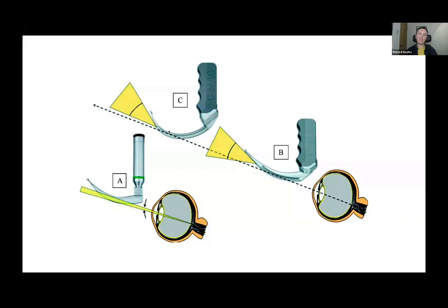So we can actually intervene in things that we can't see. We can get a tube or a bougie round the corner beyond your direct line of sight. And that's how videolaryngoscopy is more useful in terms of getting a view.